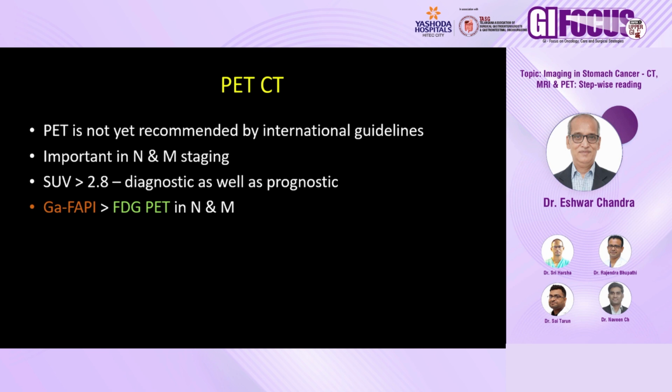Now coming to PET-CT, which we perform very routinely, but no major international societies or guidelines advocate it as the first instance. It's very important in N and M staging. A standardized uptake value of more than 2.8 is often taken as the cutoff for benign versus malignant.